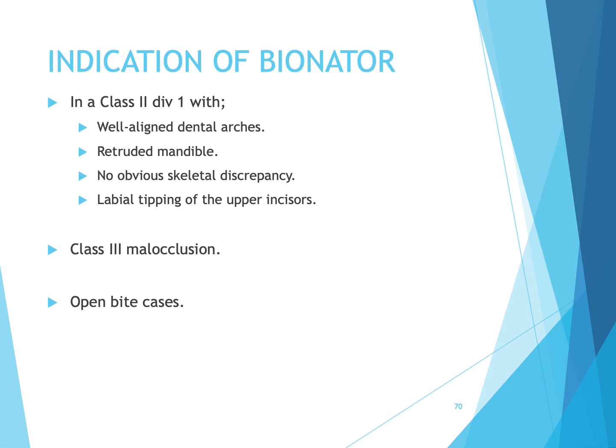Indications of Bionator. Bionator is used in Class 2 Division 1 cases with well-aligned dental arches, retruded mandible, no obvious skeletal discrepancy, and labial tipping of the upper incisors. Bionator also can be used in Class 3 malocclusion and open bite cases.